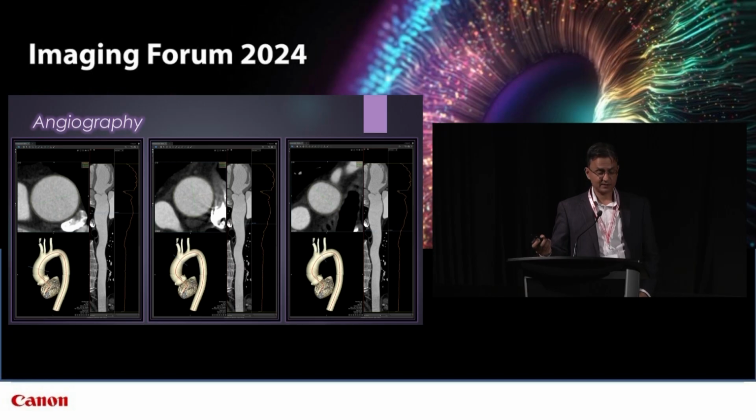Of course, this segmentation can only be as good as the CTA protocol, so optimization of tissue contrast is key to have seamless workflow. Another talk I could give on how we've achieved that using our wide volume CT. The curvilinear line on the right, and I should say, a lot of people typically show curved MPRs. This is actually a straightened MPR from a curve using the centerline functionality.